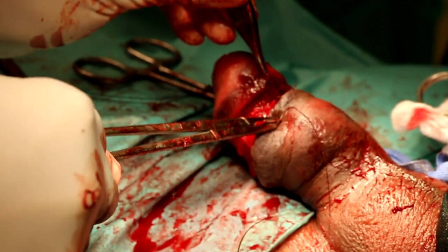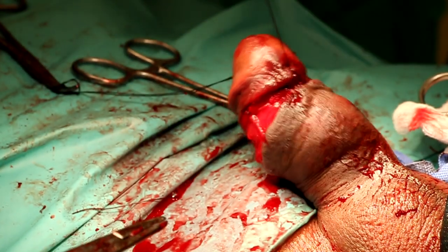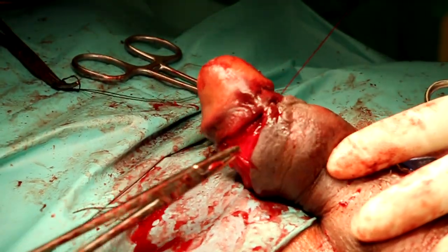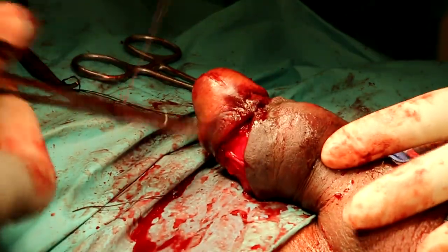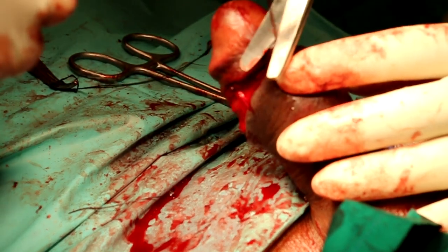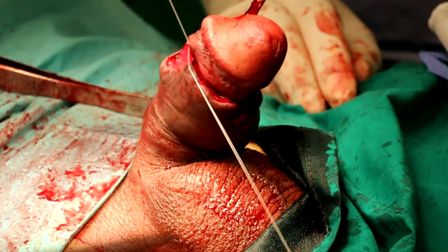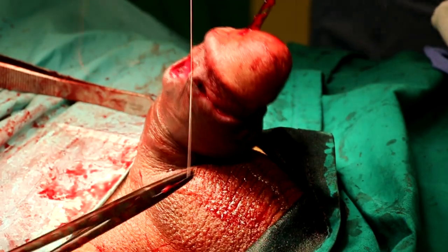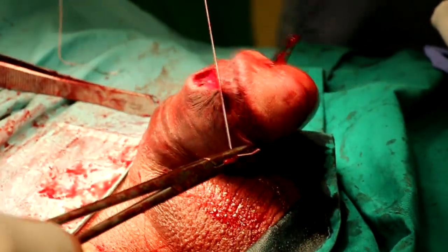Because of the edema and swelling, it's better not to close the skin from one end all around to the other end, but to take landmarks. The landmarks that can be taken are 12, 6, 3, and 9. Then you can close the skin in between. This one is at 9 o'clock. After that, you can close each quarter separately.